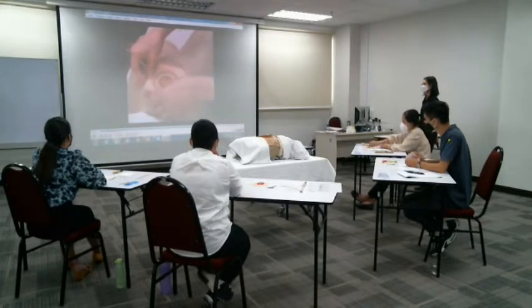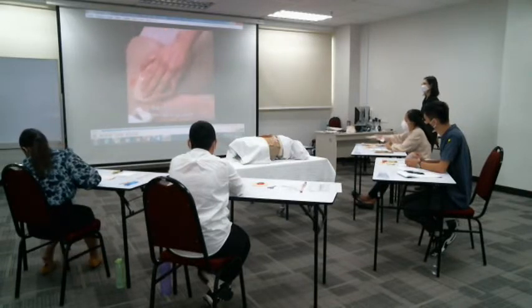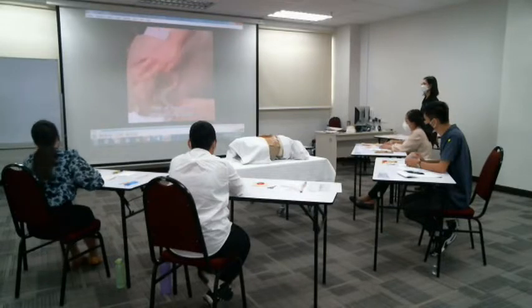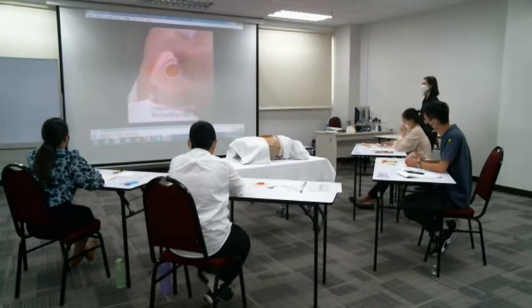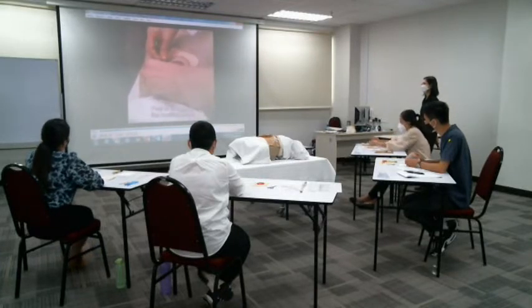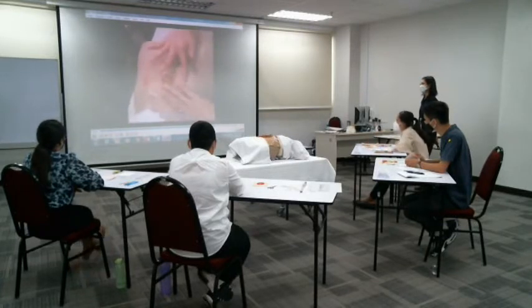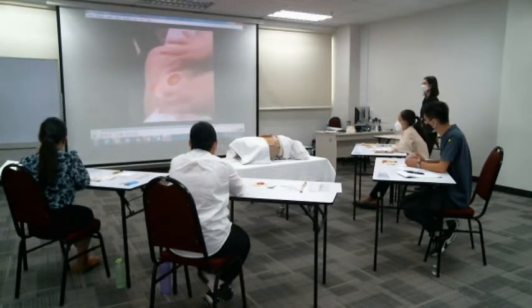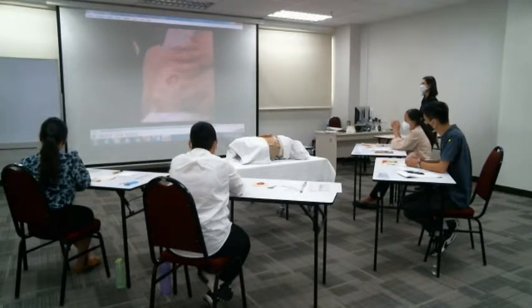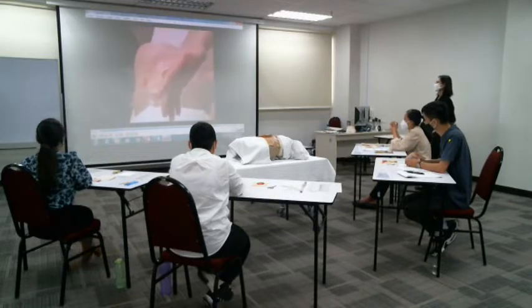Okay. Then after that, I peel off another part. Okay, make sure there's no air pocket, so inside out. Then another side. Fine. We use it to massage and make it stick very well. Alright? Okay. So this is how you place the paper with the arrow towards the patient side.